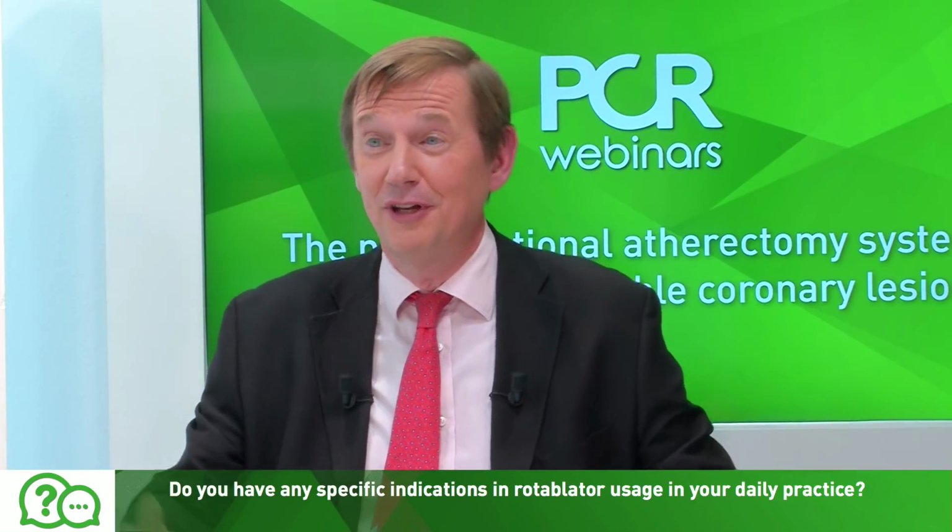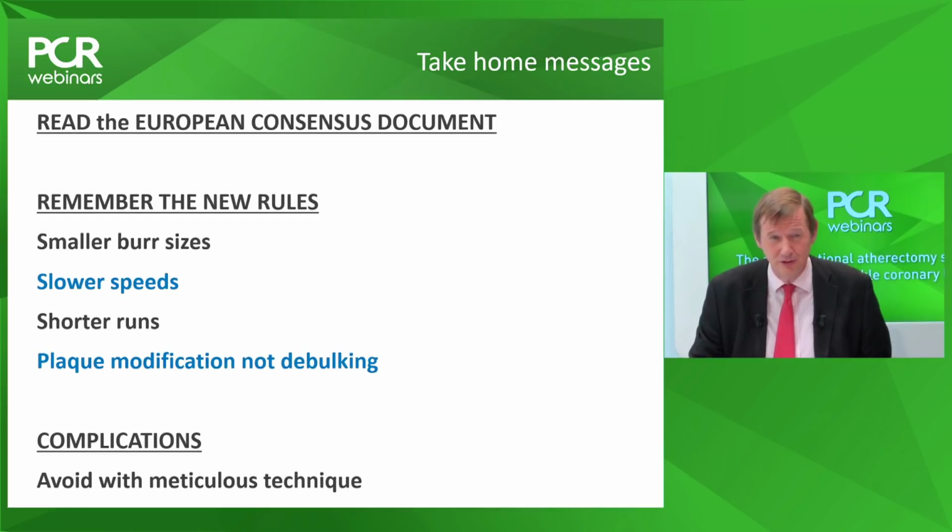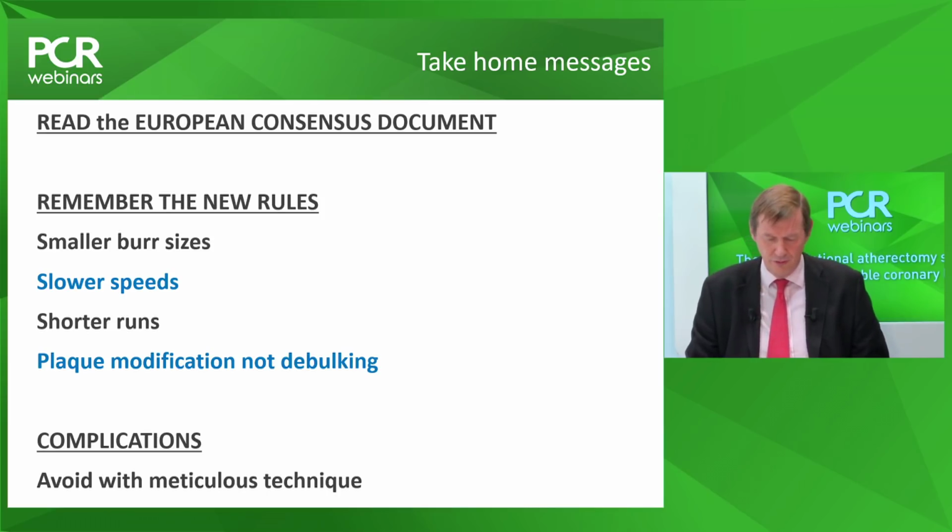So, take-home messages from this webinar. Read the European consensus document, and these are the new rules from that document. Smaller burr sizes, slower speeds, shorter runs, plaque modification, not debulking. If you do that, you'll take on very complex calcified lesions, and you'll get very good outcomes without complications. And if you use the techniques we've described and mulled over with our experts here today, then hopefully you'll be able to embrace this technology with much more confidence.